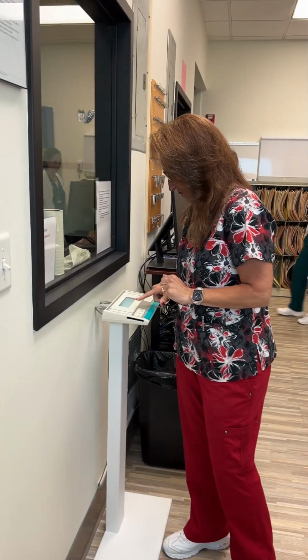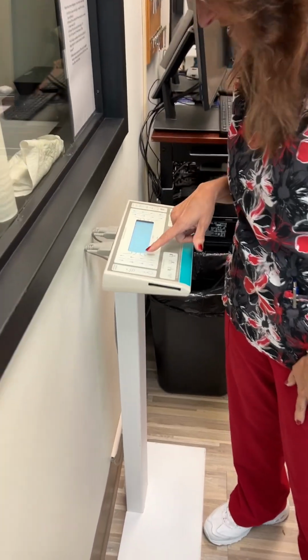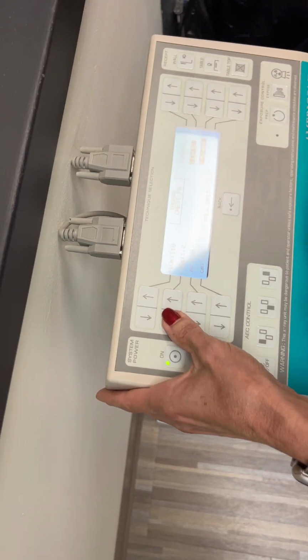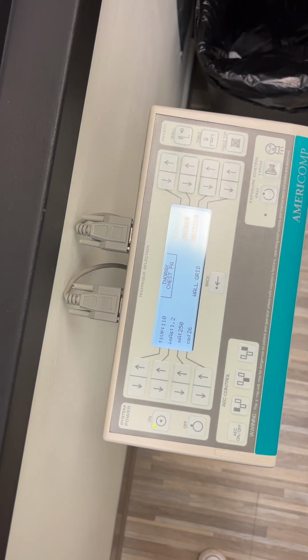In that imaging, I would likely do the chest x-ray first, so I'm going to set up for a PA chest. 110 at 1.2, 72-inch SID. So I'm going to come set the room up for that.